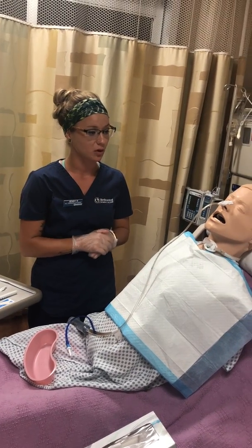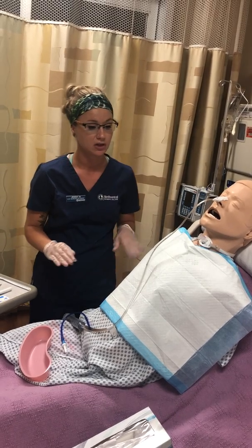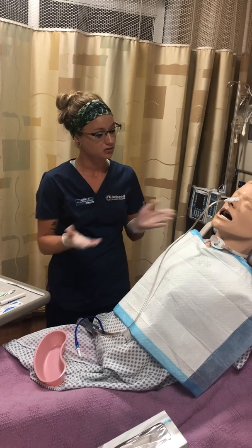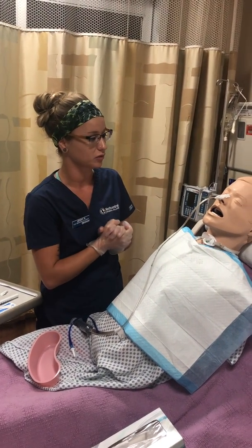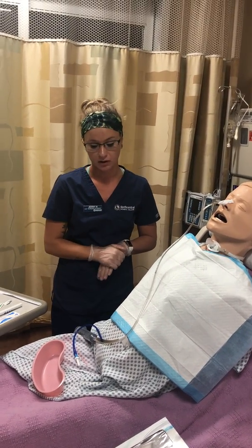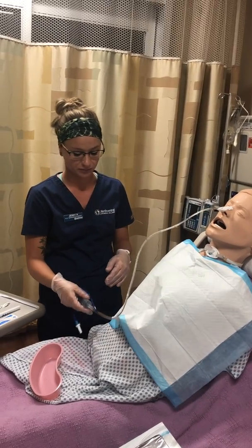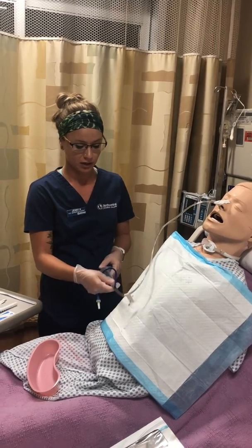Another important thing to note is do not instill any medication or attach it to suction before having confirmation through a chest x-ray. So Jennifer, I'm going to go ahead and send you down to a chest x-ray so we can confirm placement of that tube. And so when she gets back from her x-ray and placement is confirmed, I can attach to suction.